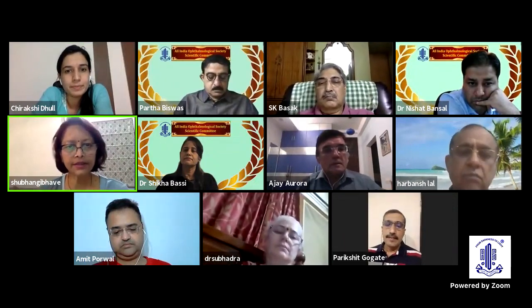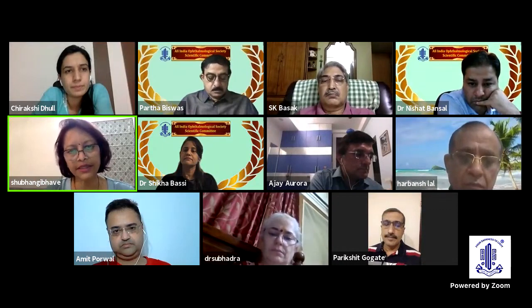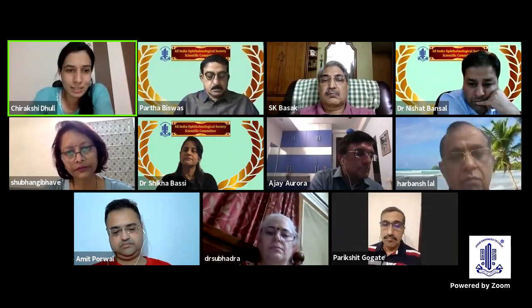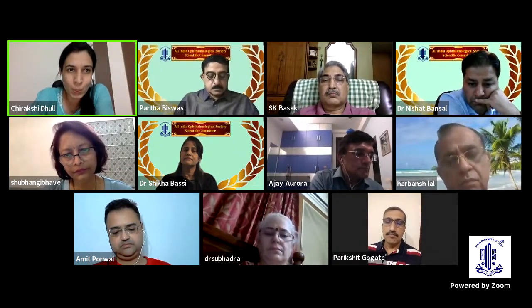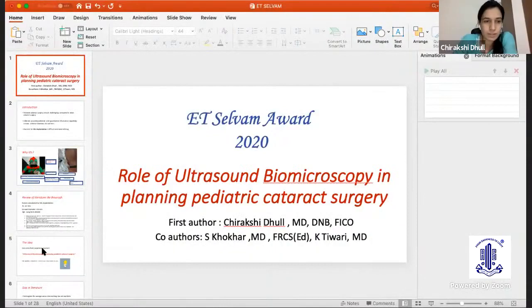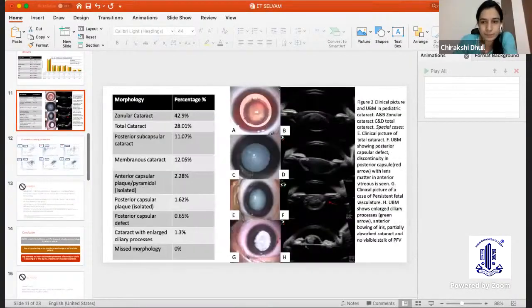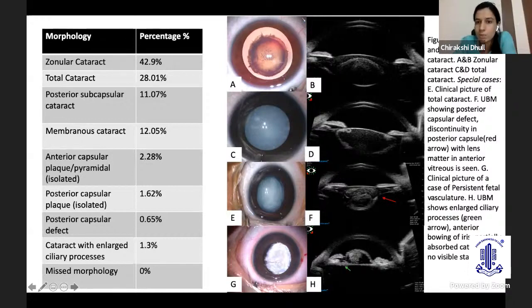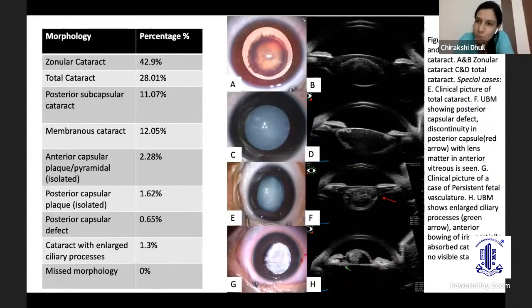If the lens is completely mature in a child, can you still see a posterior capsular defect with UBM? Yes, very clearly. In fact, that's a very good question — just look at image E and F. It's a total cataract, so you can't make out there's a posterior capsular defect clinically, but here on UBM, the posterior capsule is visible up to a certain point, then all the lens matter is in the vitreous cavity, and then it starts again. So we know there is a large posterior capsular defect. There will be no surgical surprise on the table, and we can devise our surgical technique before proceeding.